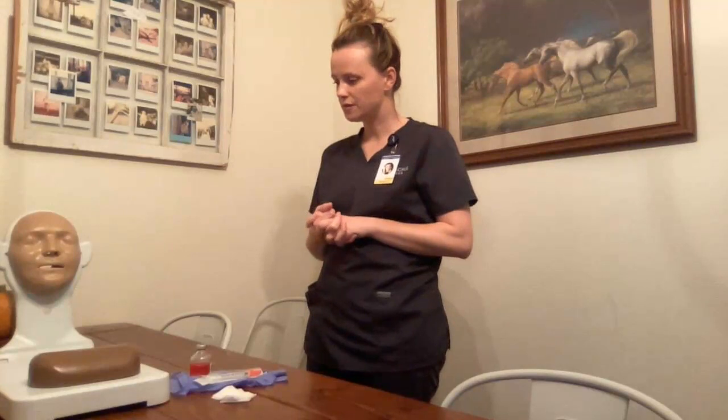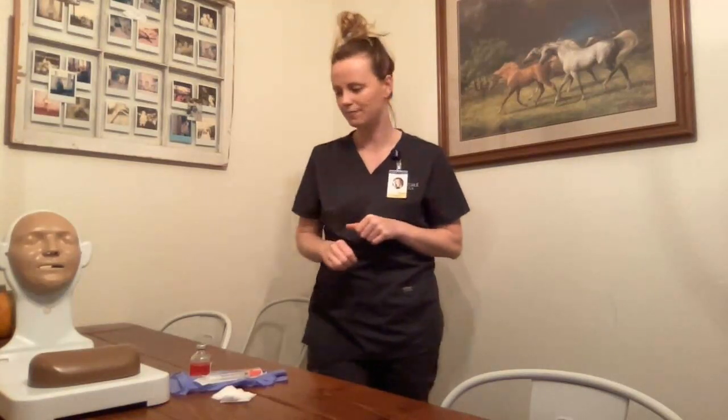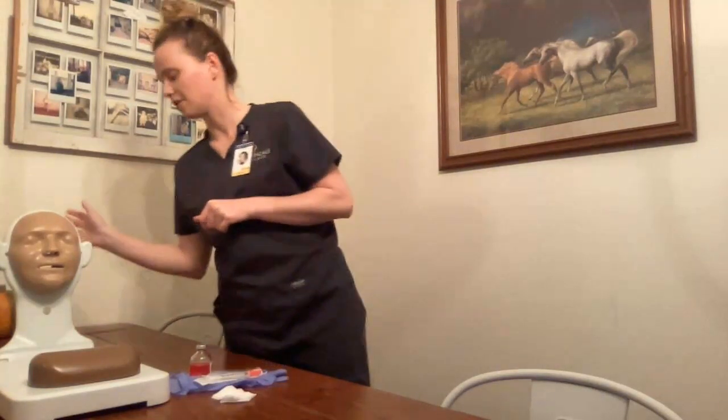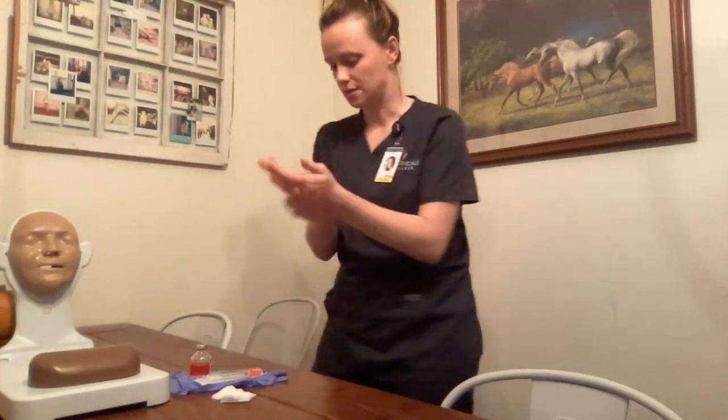Do you have any questions for me? No questions. At this point I would verify my medication for my third and last time. I'm going to come over here, perform hand hygiene, and get started.